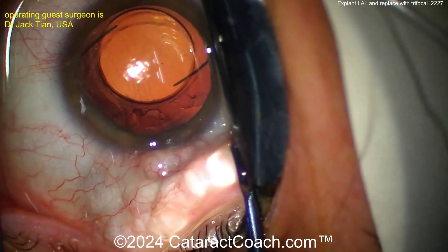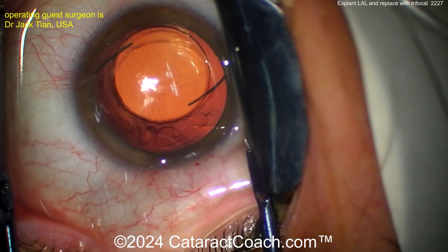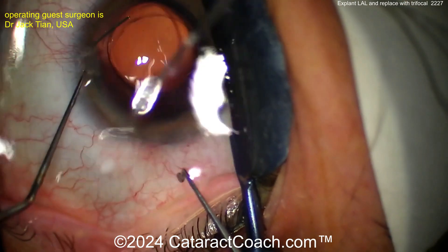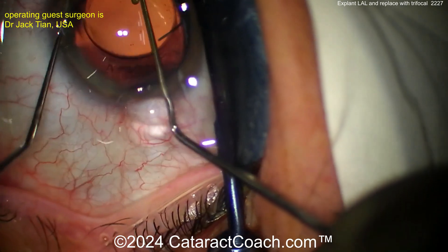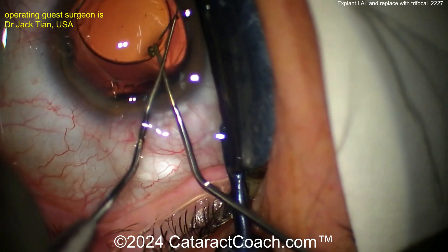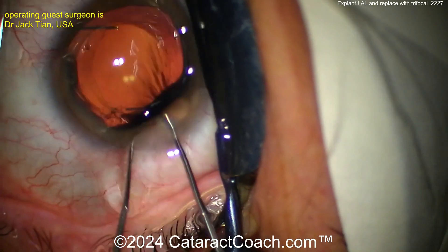You can see viscoelastic being used to do some visco dissection. Your goal is to free up this lens from the capsule bag. The challenge of course is going to be the haptics and the capsule fusion — the anterior and posterior leaflets of the capsule get fused. Here the surgeon is using a couple of hooks to deliver the haptics outside of the capsule. The optic is silicone and it's not going to stick to the capsule, so that should be relatively easy to explant. Bringing the whole lens up now.